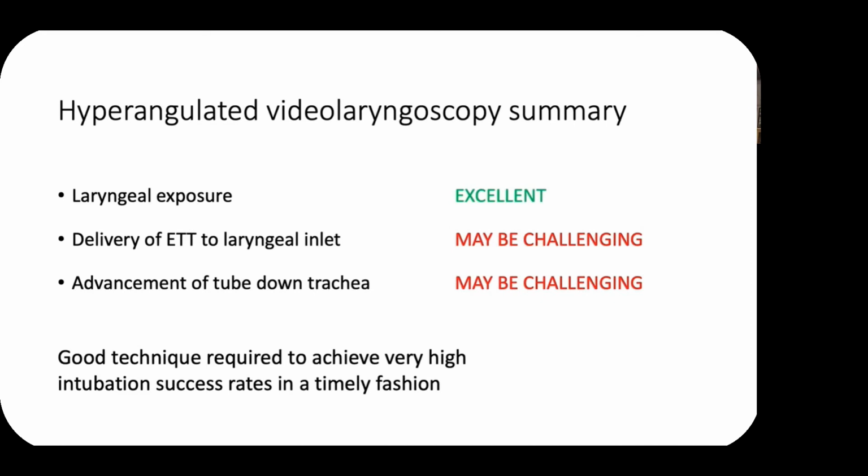To summarize, hyperangulated videolaryngoscopy usually allows very good laryngeal exposure, but in order to realize the potential for very high intubation success rates, good technique is required to overcome challenges delivering the endotracheal tube to the laryngeal inlet and advancing the tube down the trachea.